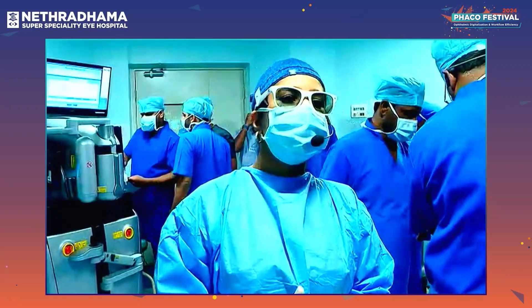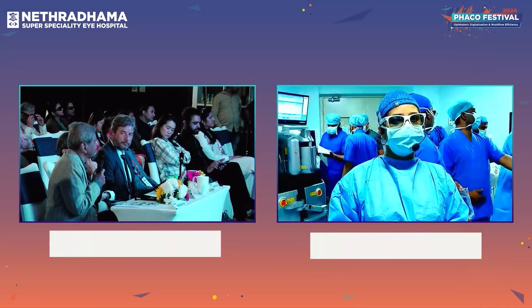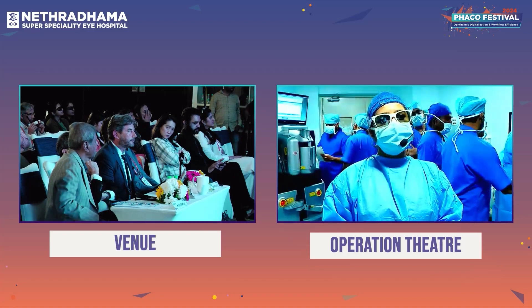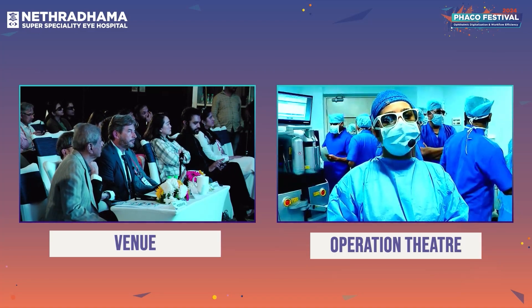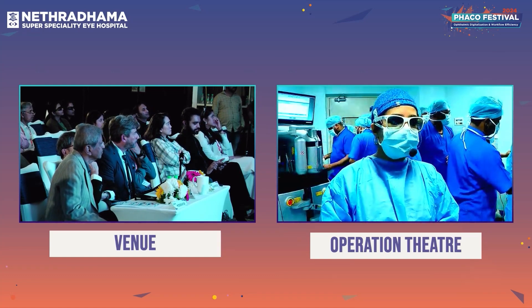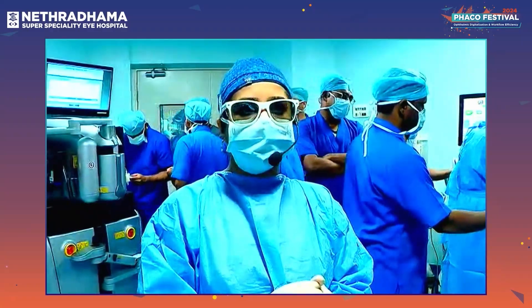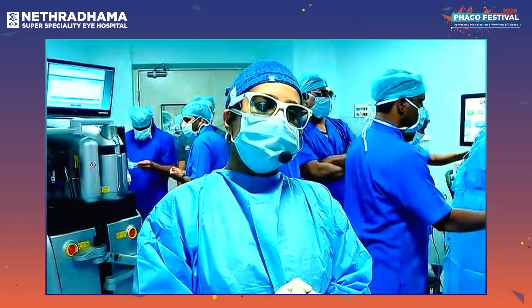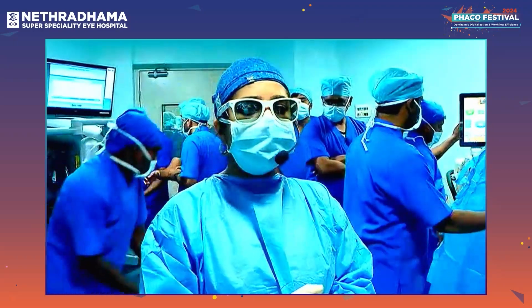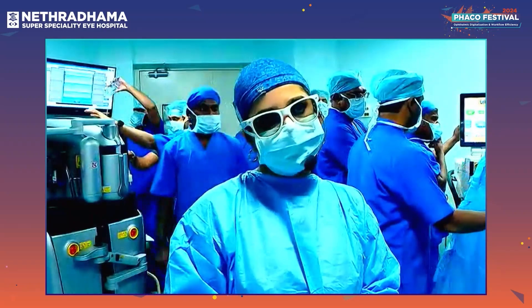This is an intumescent cataract and we expect the zonules to be a little weaker — what are the chances of a coagulated edge contracting and causing phimosis? We keep the rhexis a little bigger, at about 5.8mm, just to prevent phimosis. Intumescent cataracts are an excellent indication for this particular laser, which is why I took up this case — when it's intumescent, you don't want to do a manual rhexis because of the chance of runoff. This laser is easily attachable to the microscope and would be an excellent use for intumescent cataract, just to prevent a runoff.